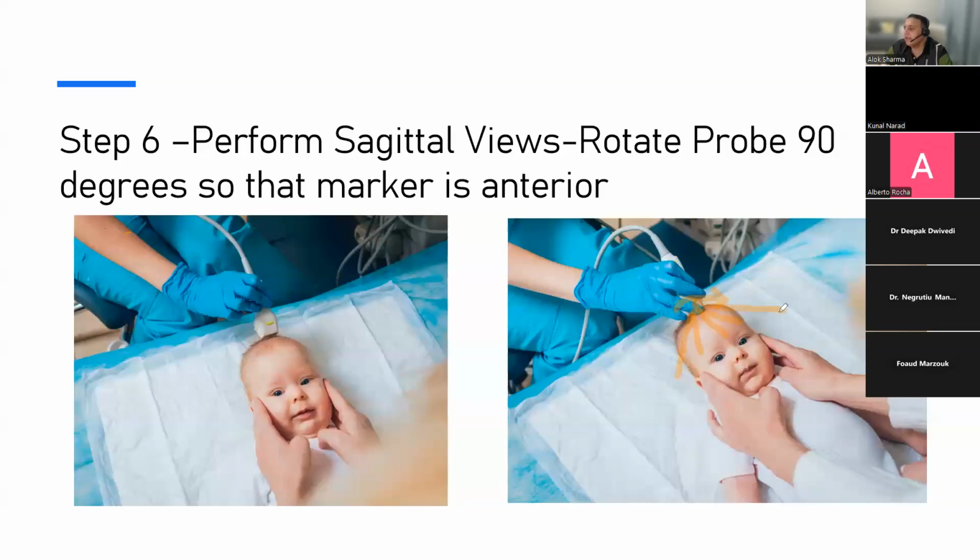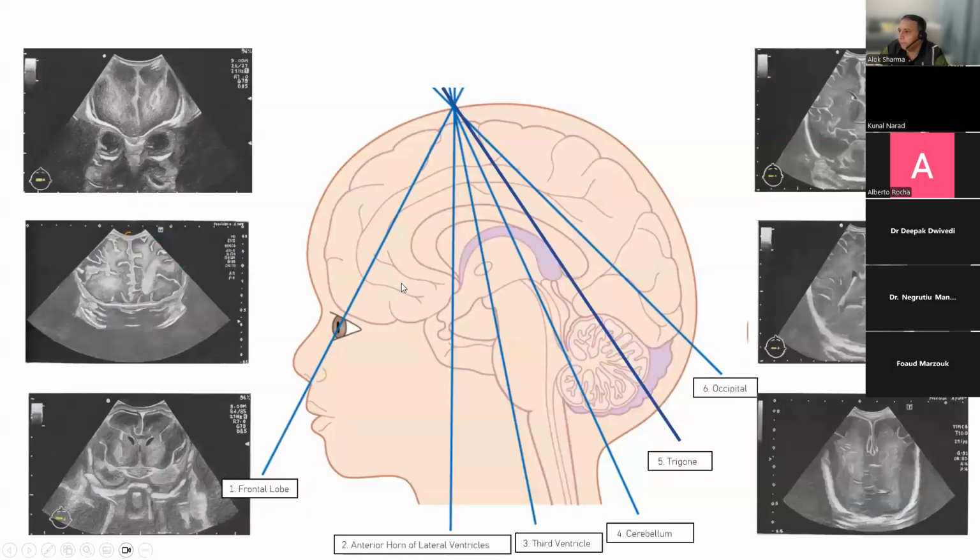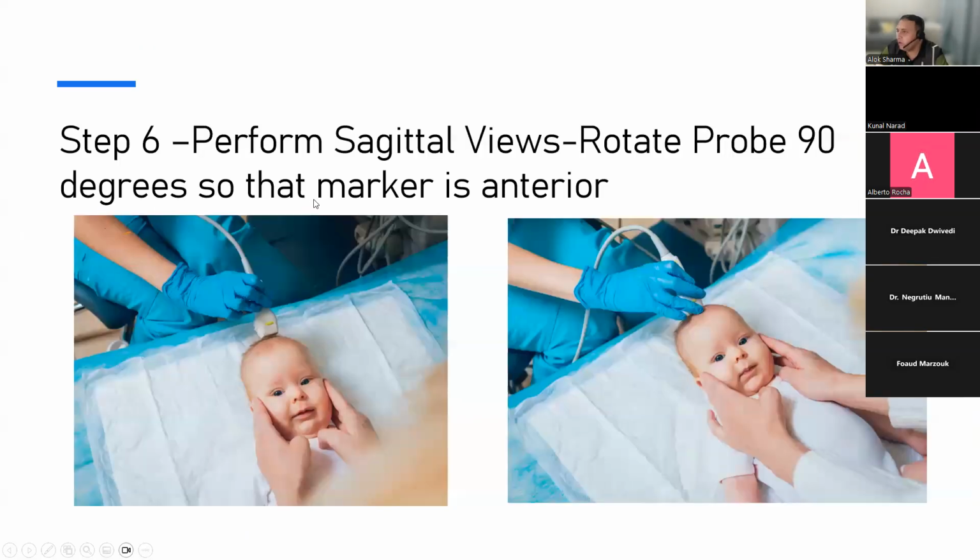And then you want to do it on the left-hand side. Normally, having a protocol of doing right from left really helps because it just means that you mark correctly. I have just a habit. I will always do the right before the left. By habit, you're more likely to have your marker on the right side already done. From your perspective, once you're in the coronal views, going back to the coronal views very quickly, you only need to have labeled right once. But when you're doing your sagittal views, you have to be aware that you're going to have right and you're going to have left. So you are going to have labels twice. So I like doing the right before the left because I can then annotate appropriately.